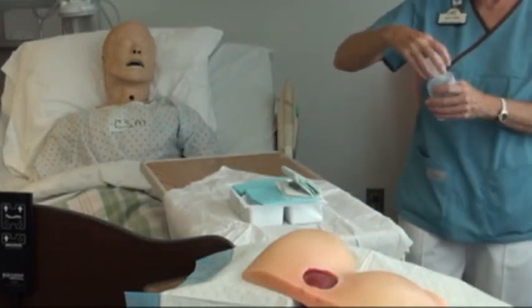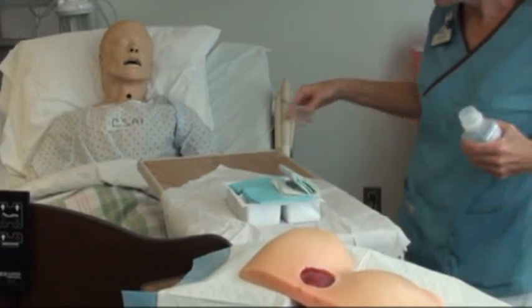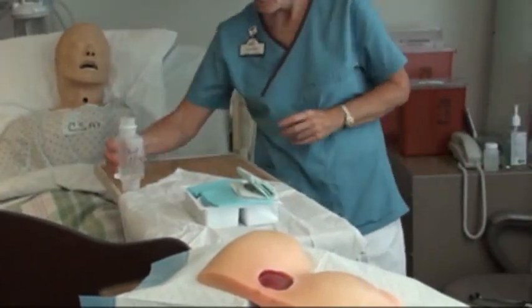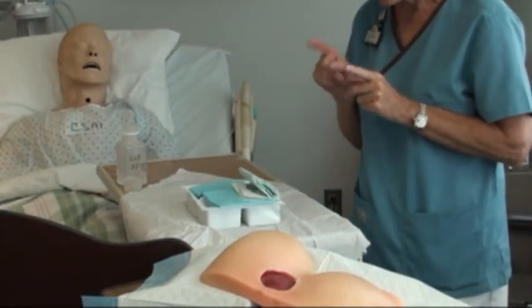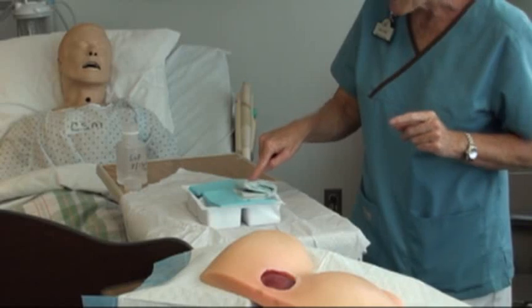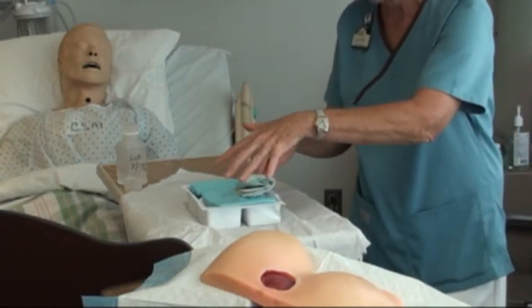I'm going to go ahead and open my bottle. The expiration is good on it and it hasn't been open more than 30 days. Now when we open the glove pack, there's a pair of gloves in it — they're latex-free, which is good. Press down on it so it'll lift up, so when you take the gloves out you won't contaminate what's there.